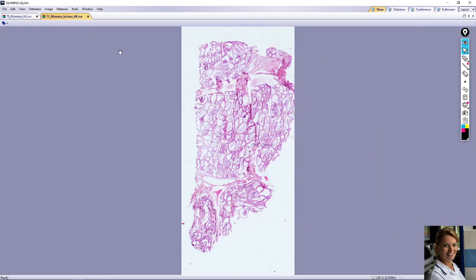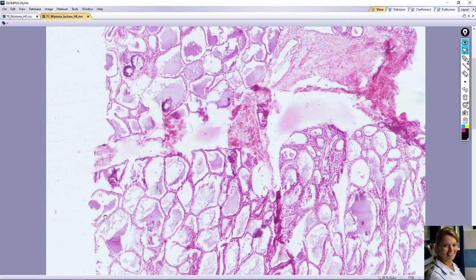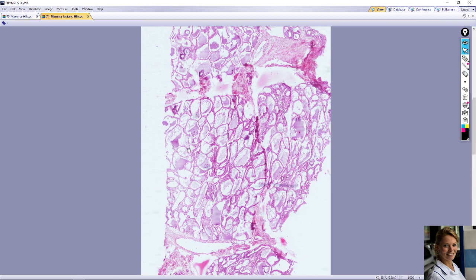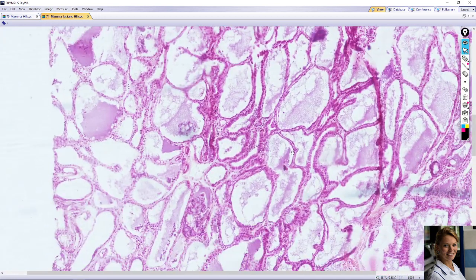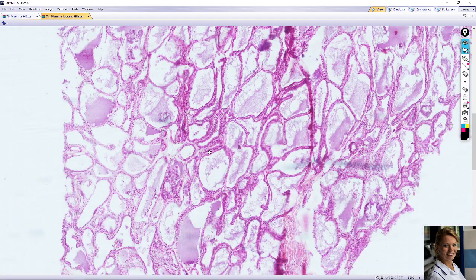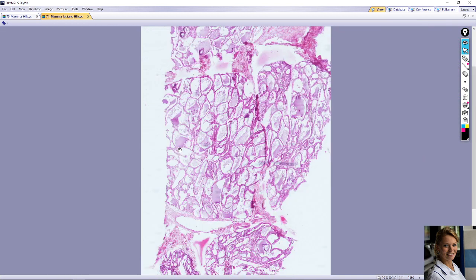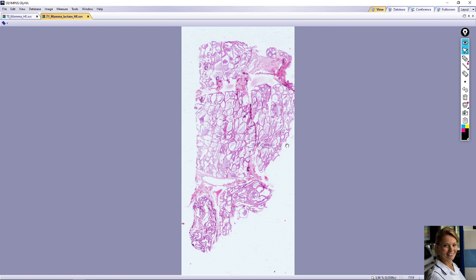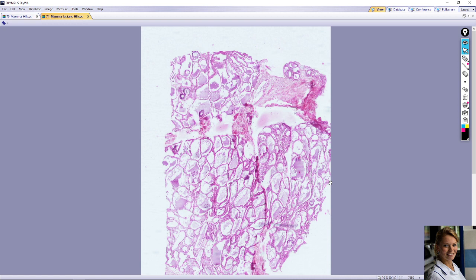Mammary gland during lactation. Lactating mammary gland exhibits distended alveoli filled with secretions. Some alveoli show irregular branching, for example here, also here, because of the increased size of the glandular epithelium. The intralobular connective tissue is reduced when compared to the inactive gland.